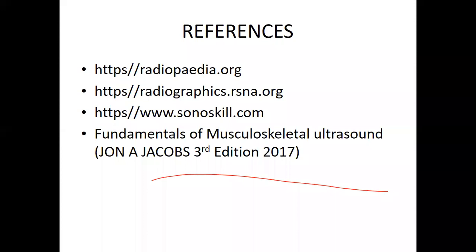So it may appear to be more hypoechoic. Now that is a sign of edema. There is an inflammation, and then color will also help you. Where there is an acute inflammation, there will be increased flow on color Doppler. So sonographically, look for two echogenicities, hypo or hyper. In chronic, you expect that it is hyperechogenic, and we must explain where that is coming from. Remember, the sequela of chronic inflammation is dystrophic calcification, which is one of the key features. So that will come out like that.